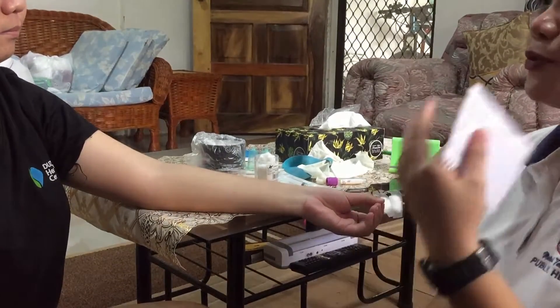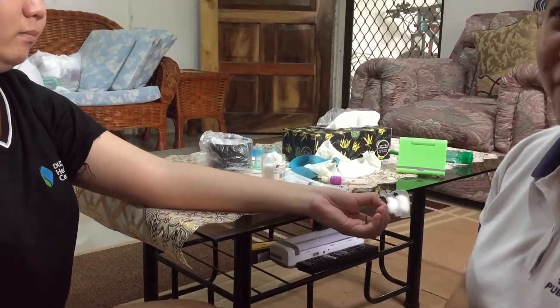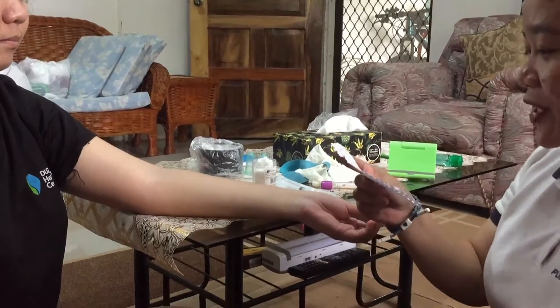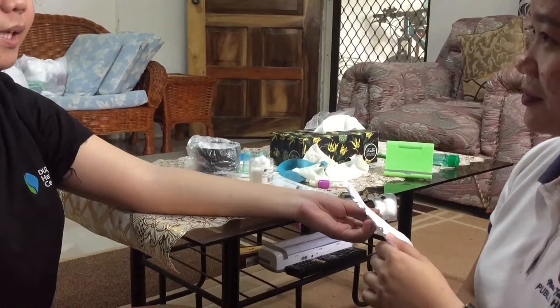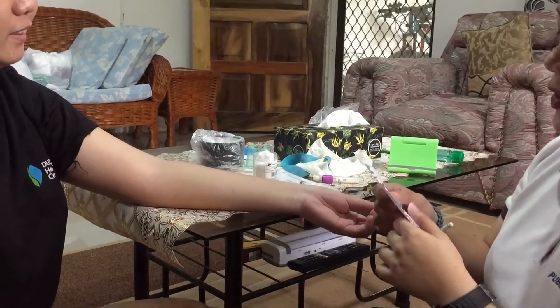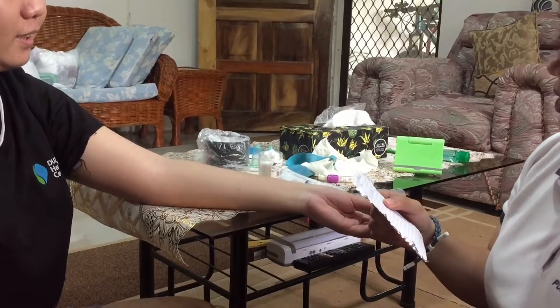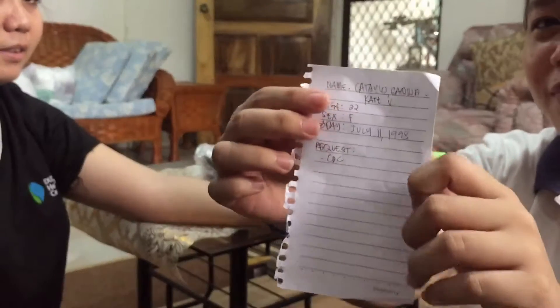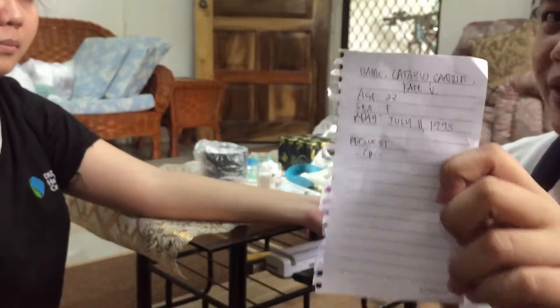So let's start. I have my friend here to help me with this procedure. Good morning, ma'am. Kindly state your name. Good morning. I'm Camille Kate B. Katailo. And your birthday, ma'am? July 11, 1998. Make sure that the name and birthday she stated corresponds with the lab request.